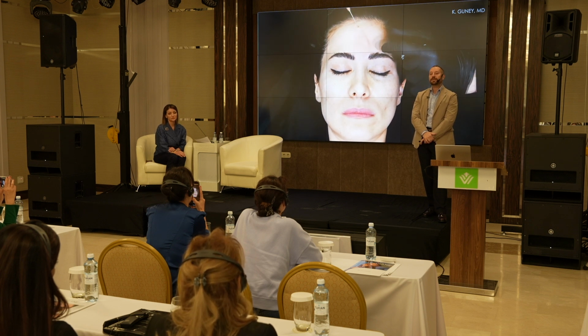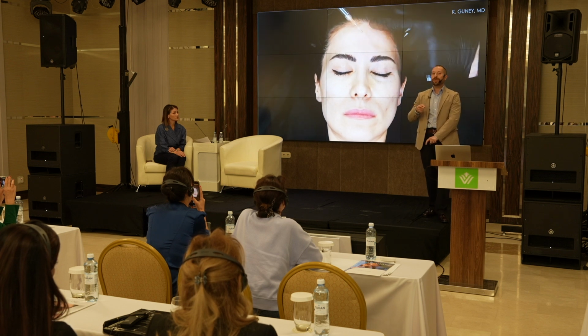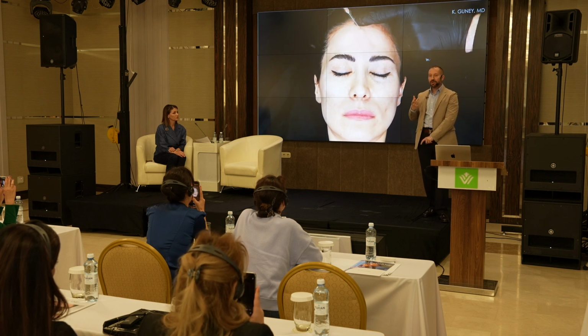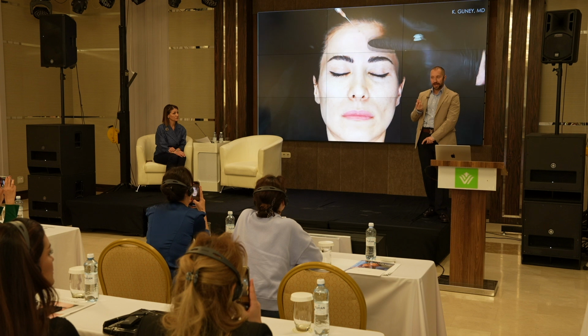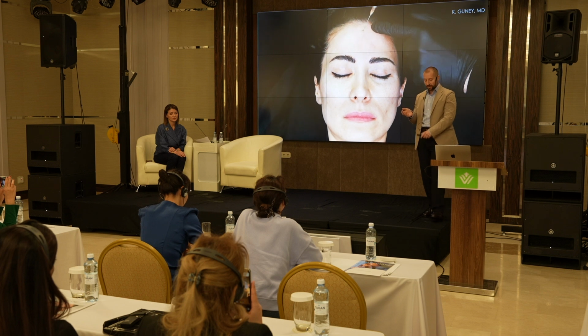Also, you can work with an anterograde technique. Do you know the differences? Retrograde, you open your way with the guide, and when you take it back, you push the product. Anterograde, you are inside, you push a little bit of product, you wait a little bit for the lidocaine inside the product, then you can push your cannula. This is anterograde and retrograde.